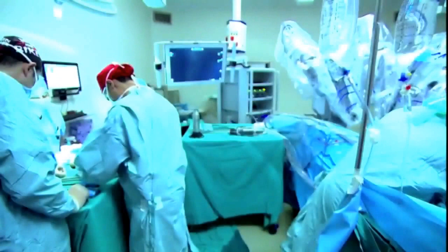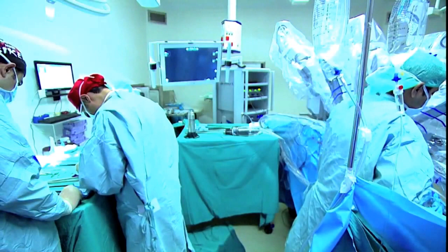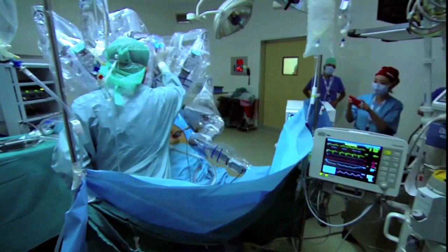So did you have any experience with multiple arteries, Dr. Gill? Two arteries each, and so we did an end to side of the branch of the smaller artery into the main artery, end to side on the back table, and then anastomosed that to the external iliac in one case. In another case, we did a conjoint Wallace type fish mouth and plugged both in together.